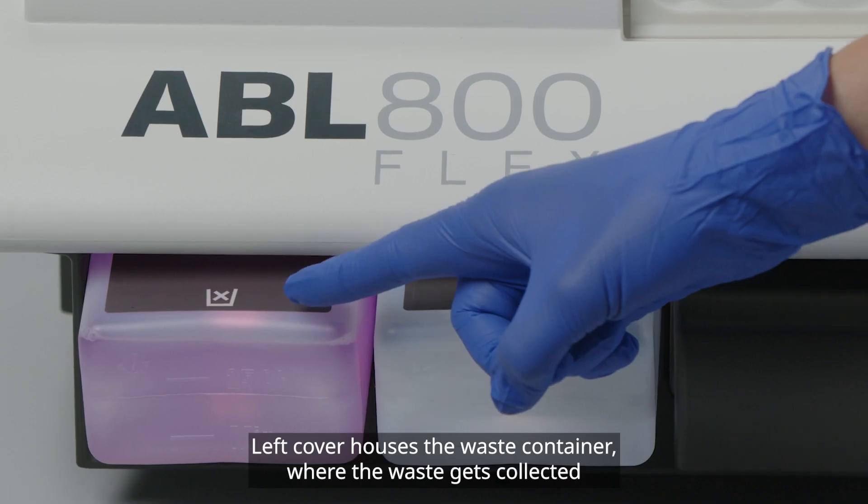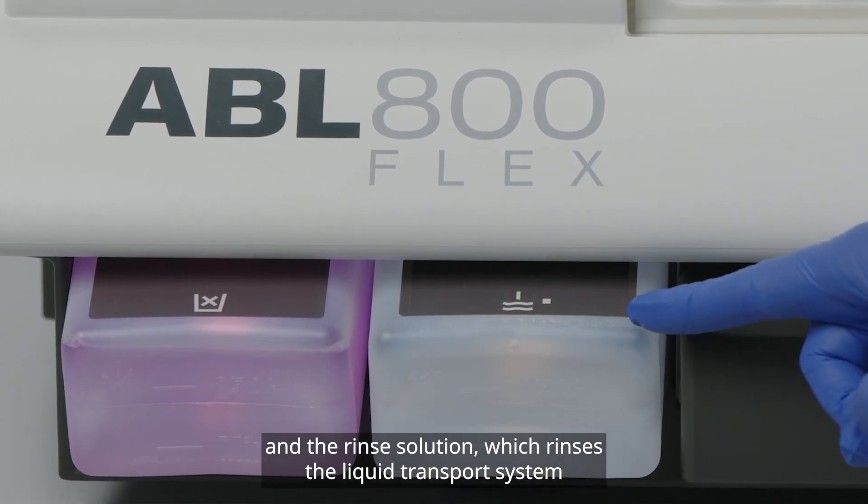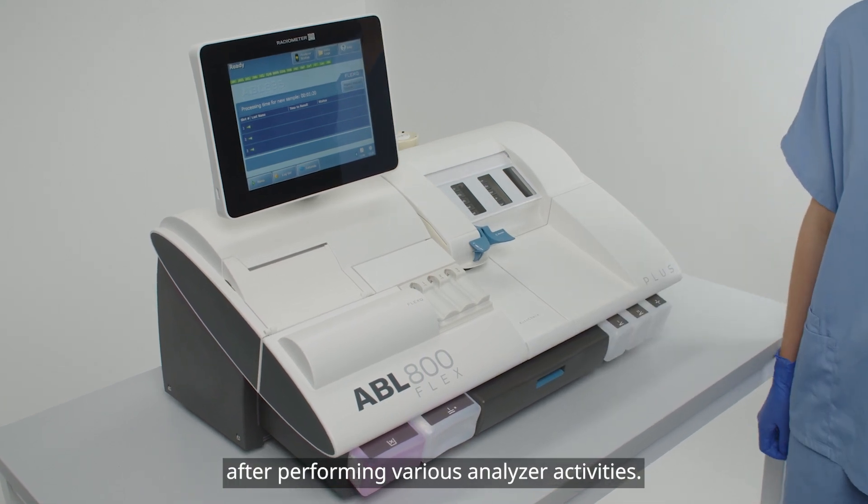The left cover houses the waste container, where the waste gets collected, and the rinse solution, which rinses the liquid transport system after performing various analyzer activities.